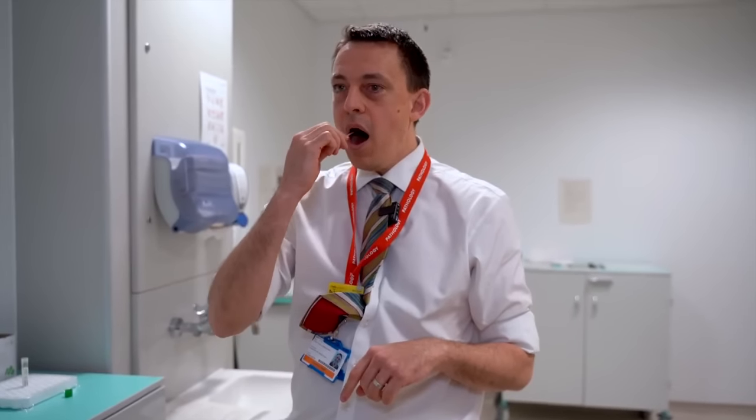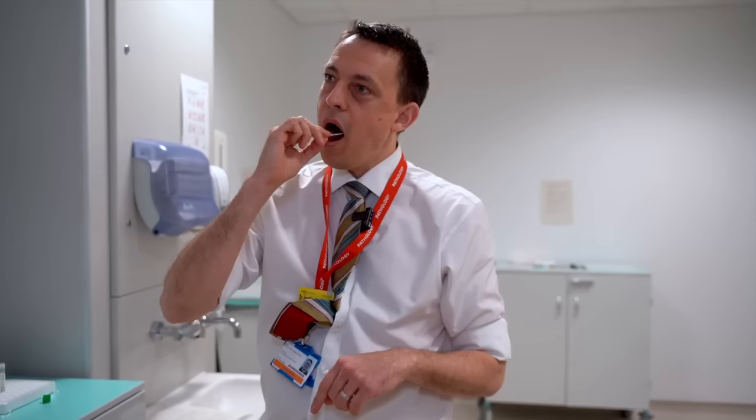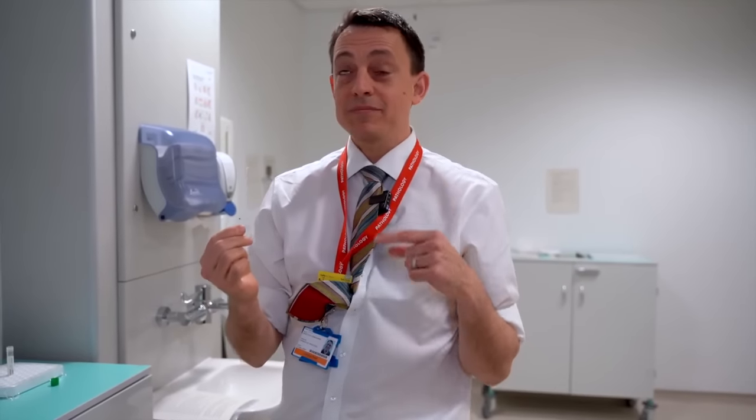So first of all, the swab goes into your throat — first on one side and then the other. If it's a properly taken swab, you should gag.